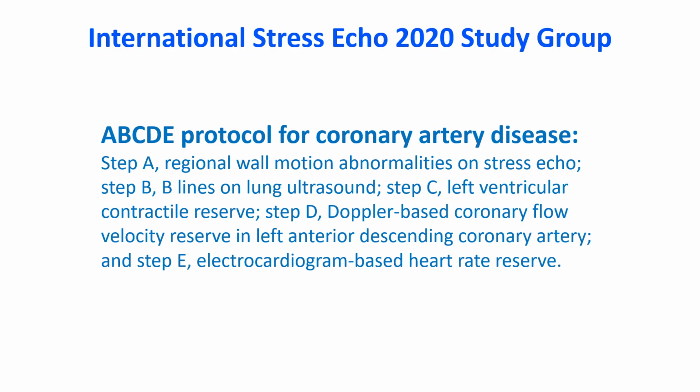Step D, Doppler-based coronary flow velocity reserve in left anterior descending coronary artery. And step E, electrocardiogram-based heart rate reserve. The study showed that the protocol was effective in prediction of survival in patients with chronic coronary syndromes. B lines on lung ultrasound indicate pulmonary edema.